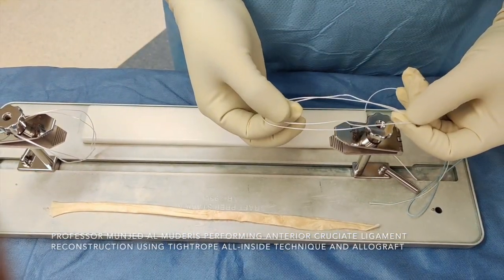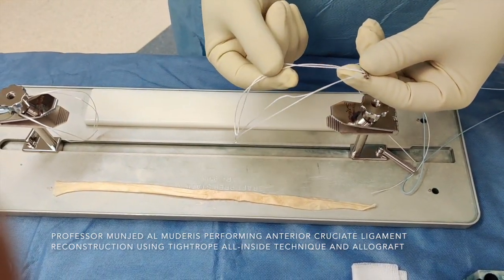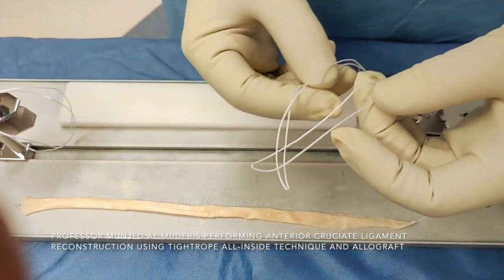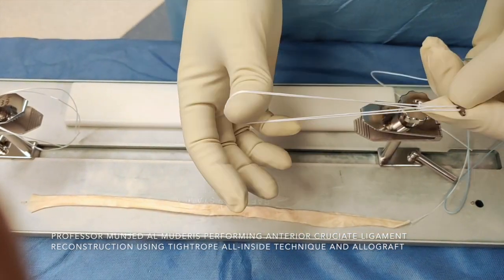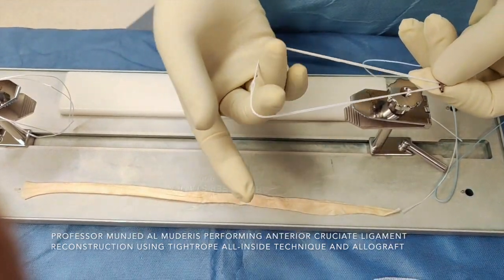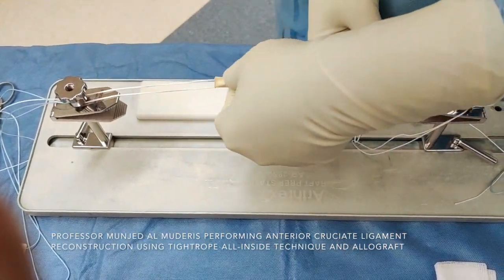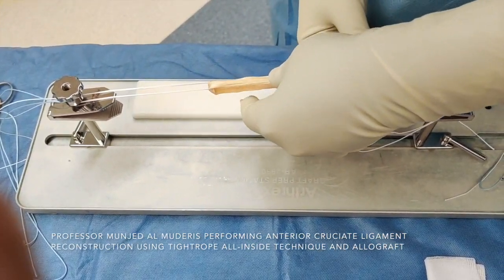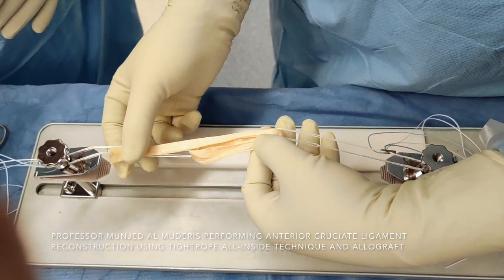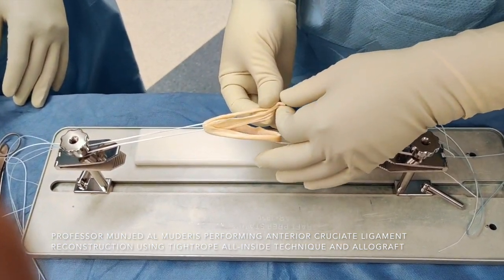Positioning the graft in the tightrope is very important. The tightrope is prepared where I can lengthen the arms from each side, and each arm should be separated. It's very important not to make a mistake with the tightrope position, as this will prevent correct tension. The allograft tendon is passed from top to bottom, and on average I leave six and a half to seven centimeters of length, clipping it from the bottom upward and then from the top downward again, so the two internal parts meet each other in the middle.